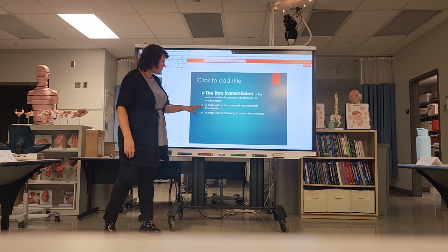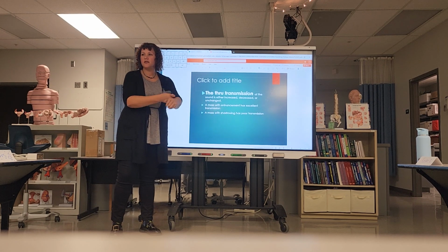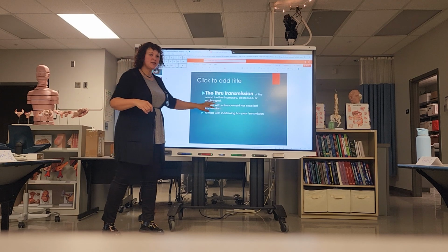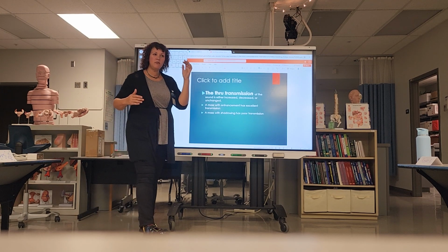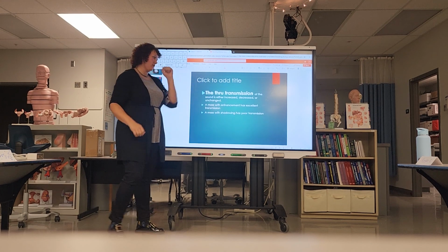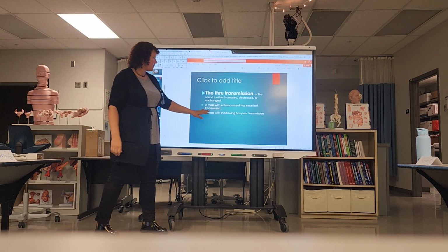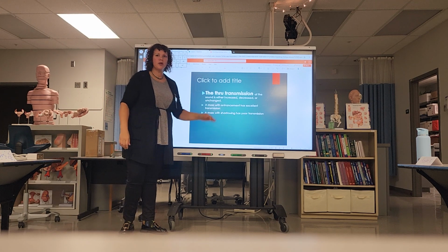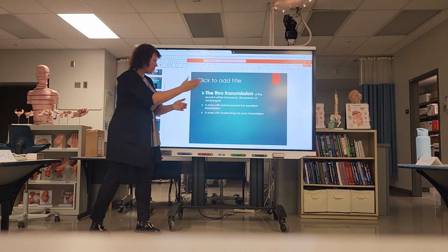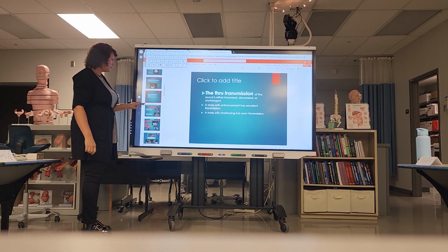So if your mass has enhancement, so let's say it's a fluid-filled cyst, it has excellent transmission. That beam has transmitted itself excellently through the structure. A mass with shadowing has poor transmission. So the beam cannot pass through that very dense structure. Does that make sense?